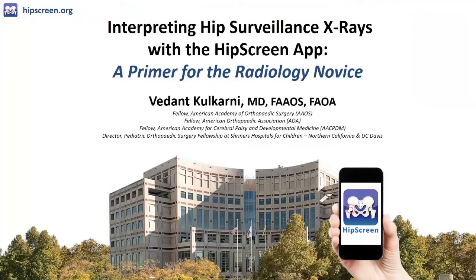Thanks so much for joining me for this presentation on interpreting hip surveillance x-rays with the HipScreen app, a primer for the radiology novice. My name is Vedant Kulkarni, and I'm a pediatric orthopedic surgeon at Shriners Hospitals for Children in Northern California. And the goal of this presentation is to give you the fundamentals of how to interpret an x-ray for hip surveillance in a child with cerebral palsy.